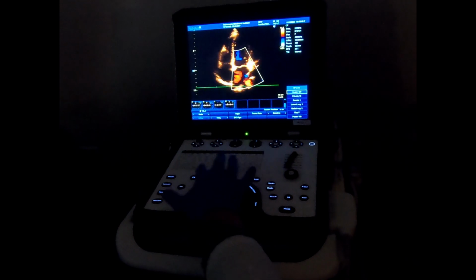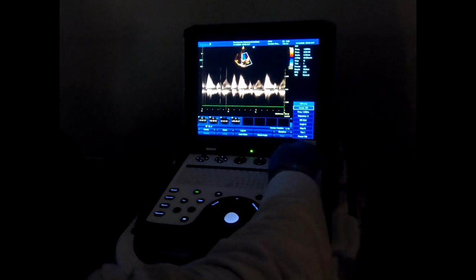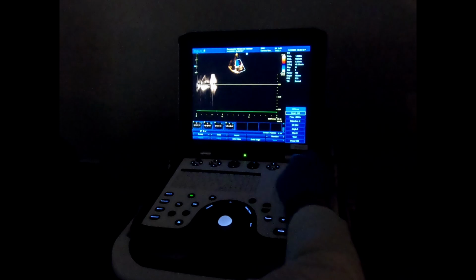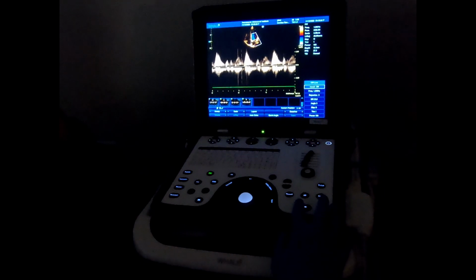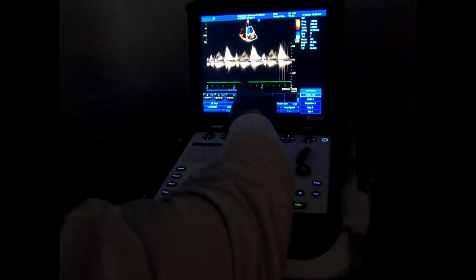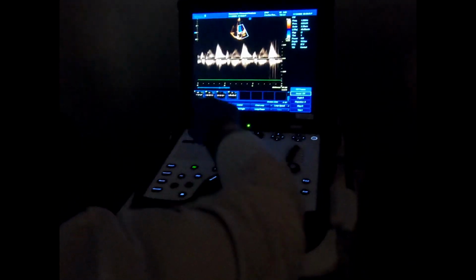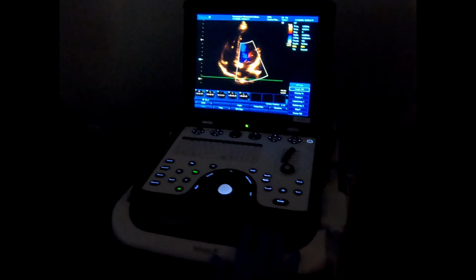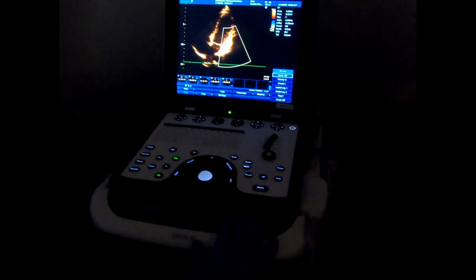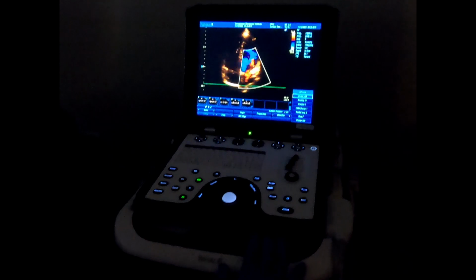If there is no MR, you still need to go below the valve and change your baseline like this, because now you're focusing on the MR. So you need to show this part. That's your proof that there is no MR. If there's an MR, the continuous wave Doppler will pick it up and it will be down here after the A wave. Aren't you mostly proving that there's no central MR? Because if there's an eccentric one, that's why I put color Doppler first to look it up. Then you change the angle the way you want for eccentric and line yourself up with that.